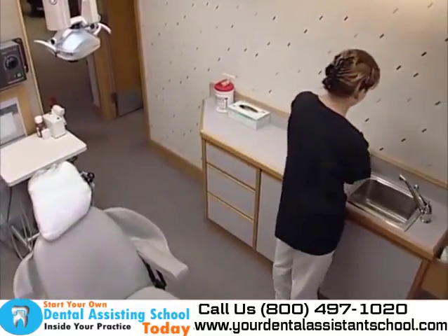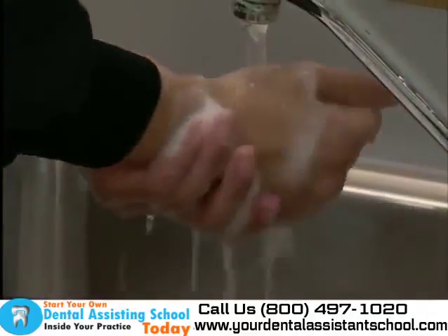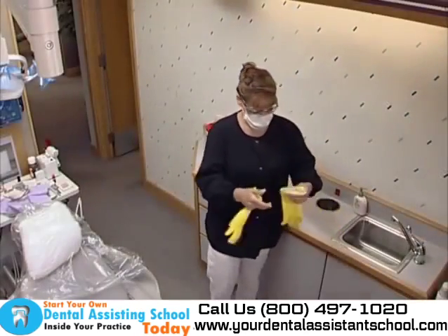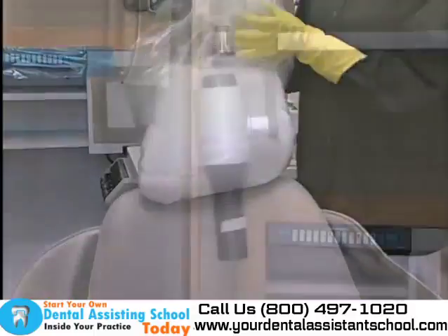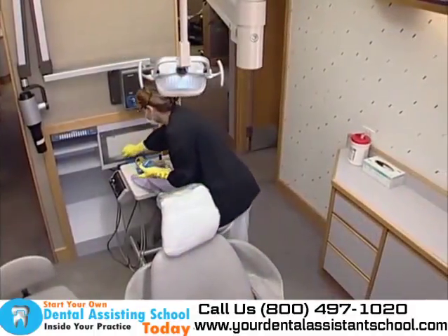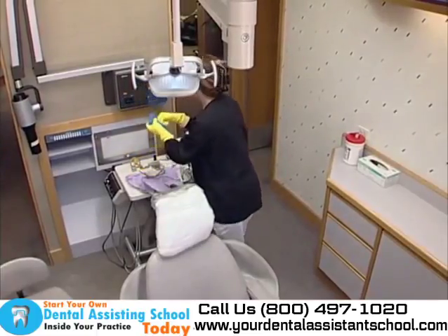Before the next patient is brought in, the treatment room must be cleaned. The dental assistant washes her or his hands and puts on utility gloves. Plastic barriers from the lights, chair, and X-ray head are removed. This helps prevent potential contamination and protects the dental staff and the patients.